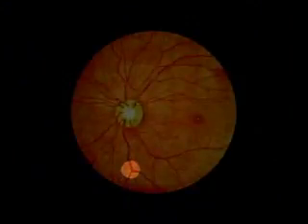While holding the red reflex in view, approach the patient's eye along a 15-degree line lateral to her line of vision until the ophthalmoscope is close to the eye. Try to find the optic disc by following the retinal vessels toward the place where they converge.